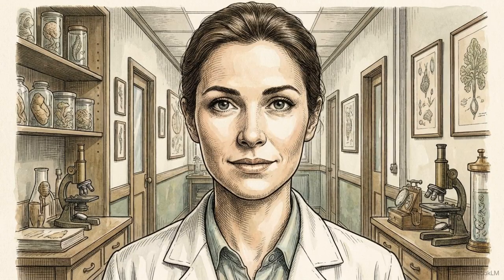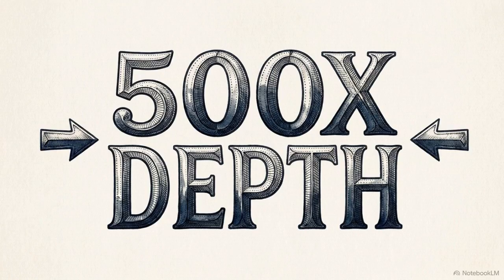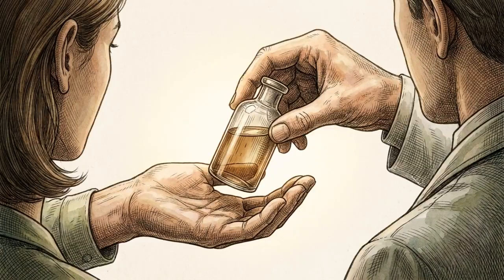In clinical sequencing, data quality is the basis for trust. By enforcing strict Q scores, demanding high read depths, and ensuring precise alignment, we convert a massive dataset into the specific evidence an oncologist needs to select a treatment.